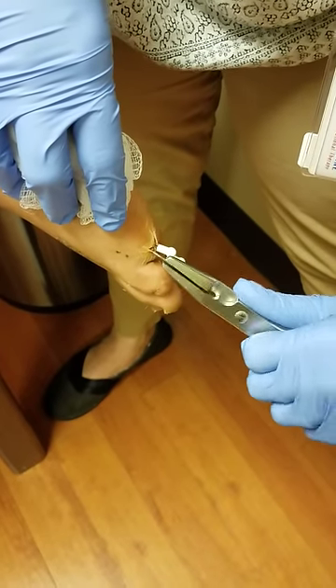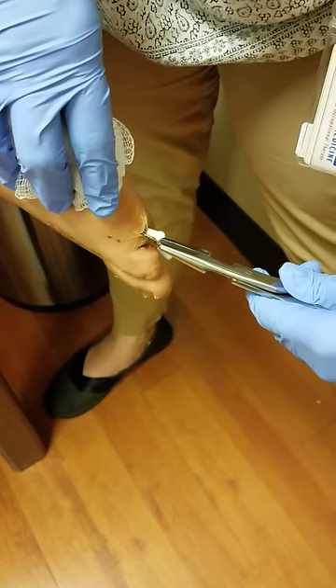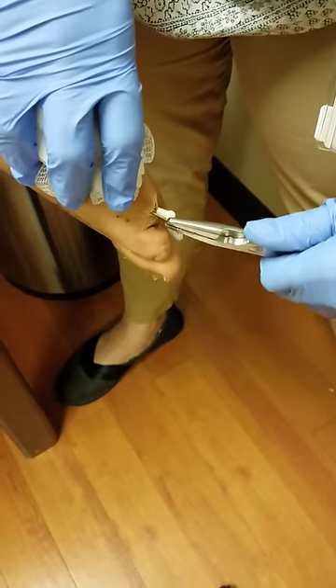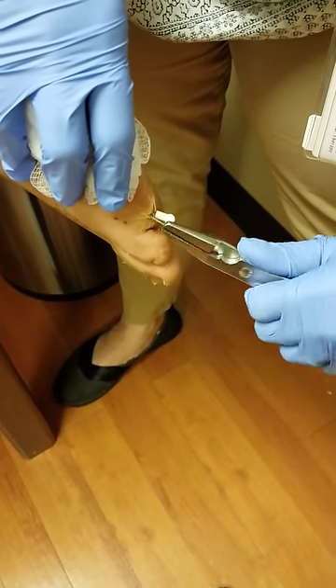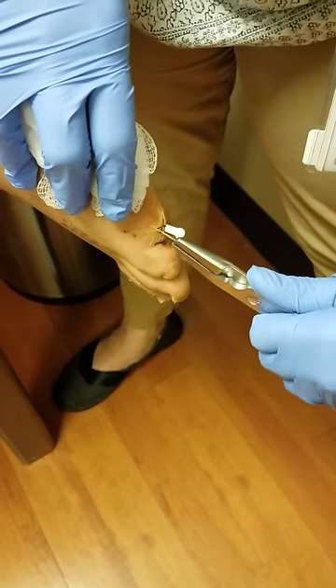Once it slides out, she's going to probably feel a little bit, but not much. Does it hurt? You okay? It does hurt. I was looking to say, three weeks away — what's it feel like? Like a pinch. Like you're getting a sand spur out, like a purple sand spur.